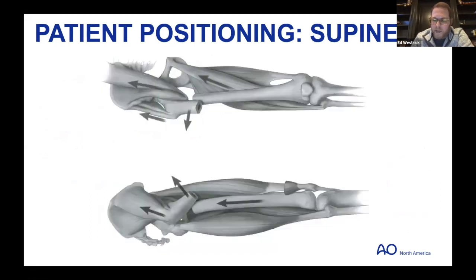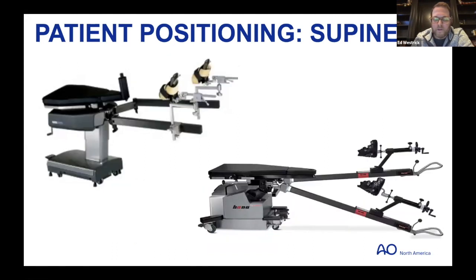I would say the only caveat would be, if you really truly are somewhere out there on your own, you have no qualified assistant, this may be your only option for traction. This can take the place of at least somebody doing that. So that would be really the only time I could see this could be useful for a subtroch fracture. Do you guys feel otherwise?